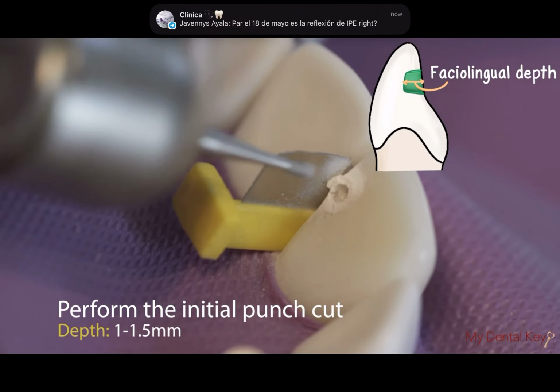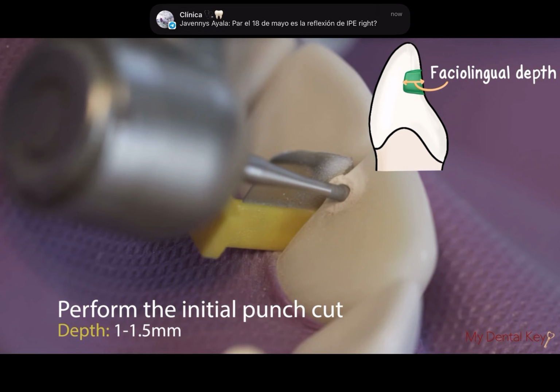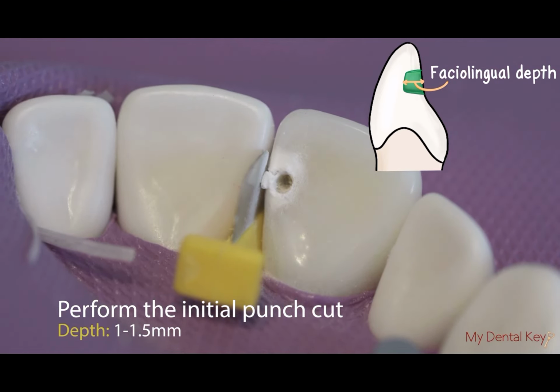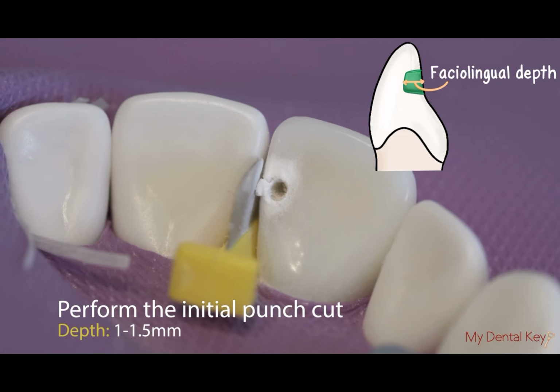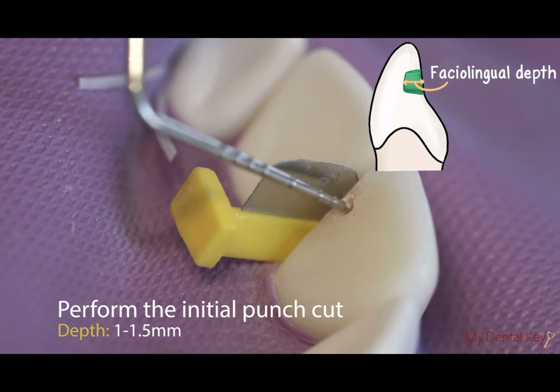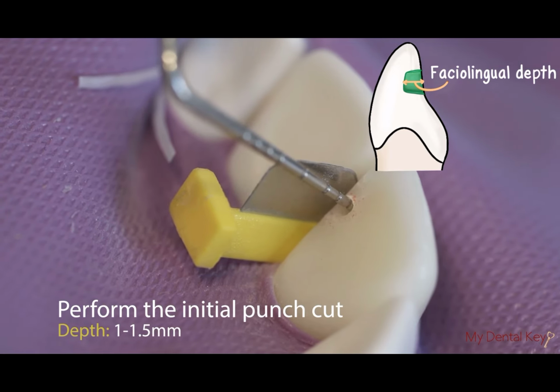Penetrate the tooth to an initial facial lingual depth of 1 to 1.5 millimeters. Note that this tooth does have caries, so you may feel a drop while drilling. Use the probe to check your dimensions. Here you see that the initial depth is 1.25 millimeters.